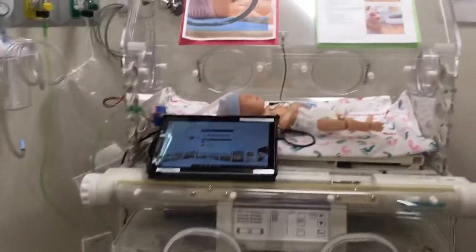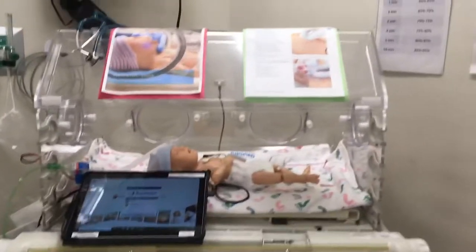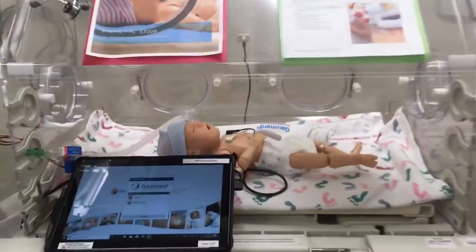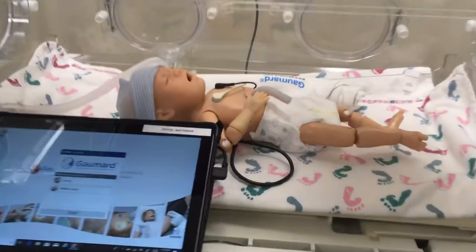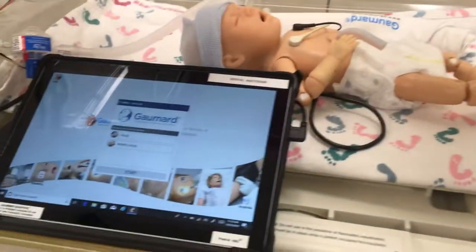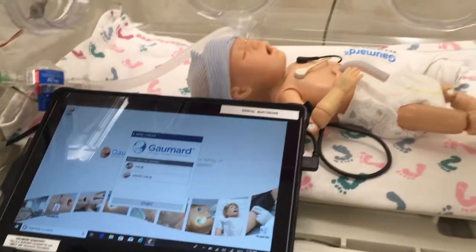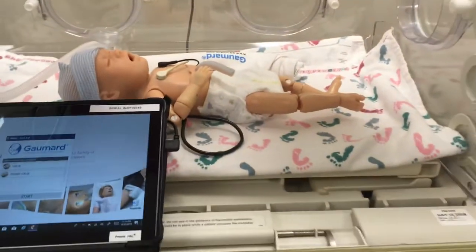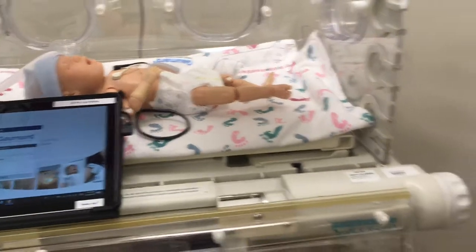And here we have a preemie — we call him Ace. I am currently working on starting him up. His battery died, so we're working on that.